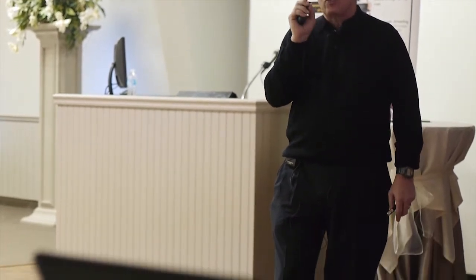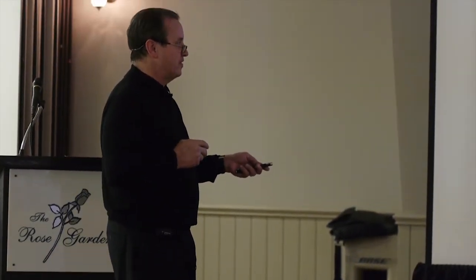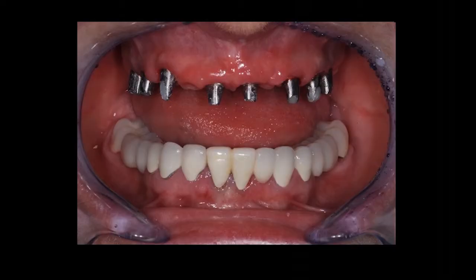Now you made a horizontal cut with piezo all the way down the ridge, or did you not just start? I use a piezo just to do my initial osteotomy instead of a drill, because you have more control. With the drill, it kind of tends to want to go wherever. And this is such a delicate case that I wanted to make sure I didn't do anything to screw it up. And that, you know, it meant slowing down and taking a few deep breaths, but you know, we got this going on at that initial visit, and it really worked out well.